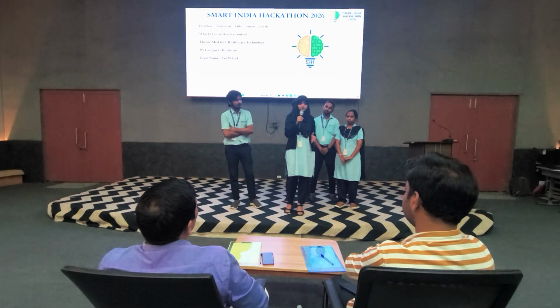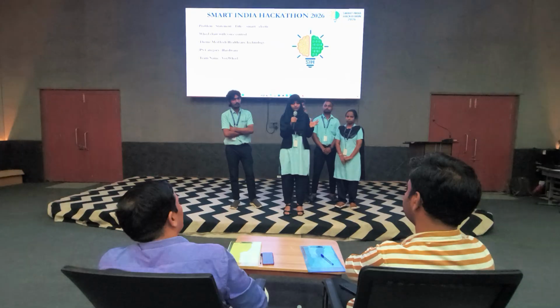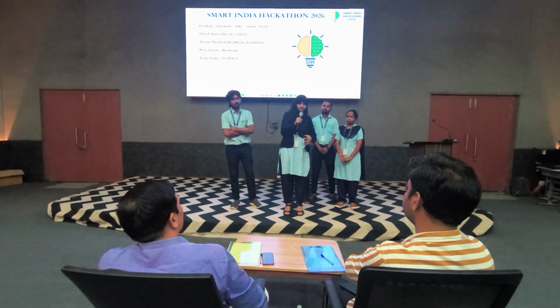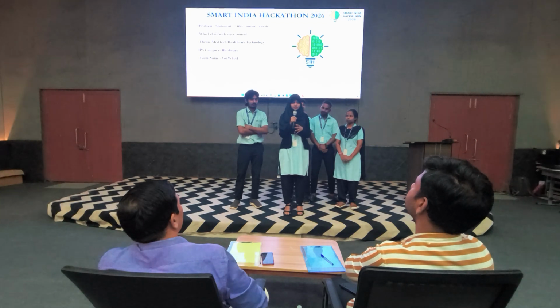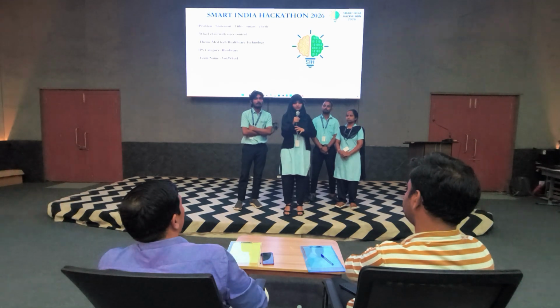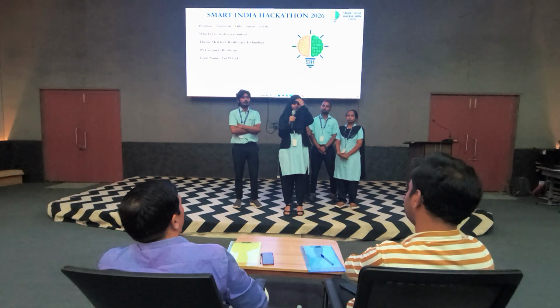But our agenda is to make it work at that exact time, at 0.5 seconds. When they give a command, move forward, it should move forward at that time only. This agenda will make us different from the present projects. It is our main aim.